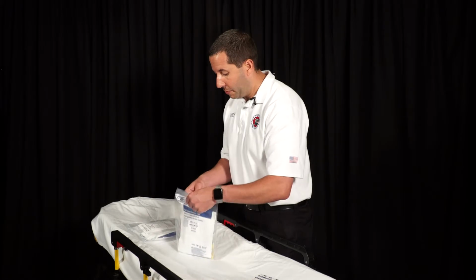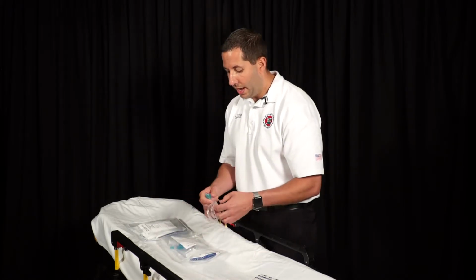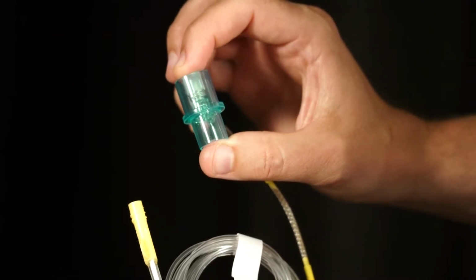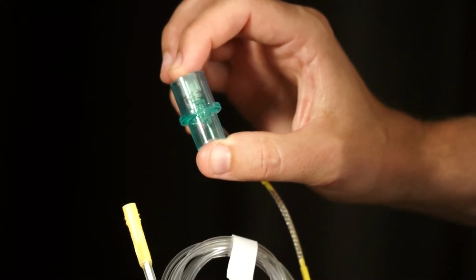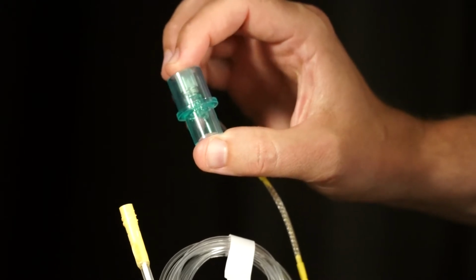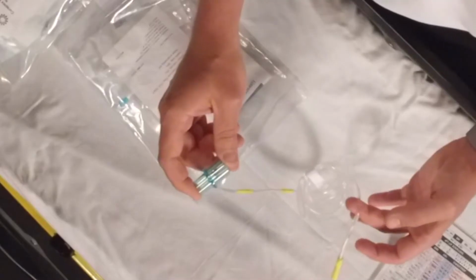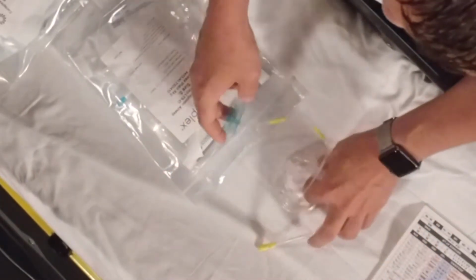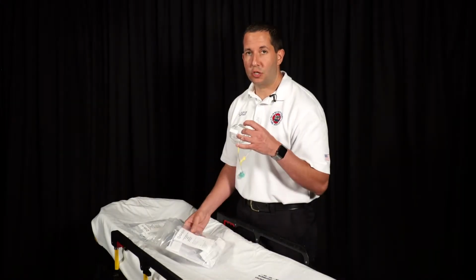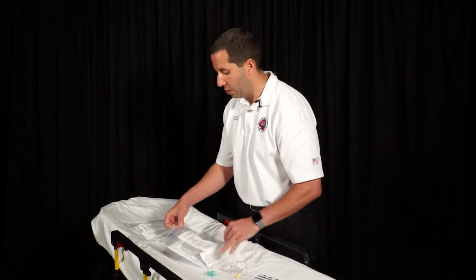So I'm going to open up the bag for the size 0, and as you can see, it also has a different inline filter. The purpose of this inline filter is it has a collapsible spring. The collapsible spring is to prevent the dead space from the regular inline filter, making sure that it pulls a good sample up and you're able to get an accurate end-tidal CO2 reading. So when you get this bag on your rescue truck or engine at size 0, it's going to have a specific inline filter that you should be utilizing when using this piece of equipment.